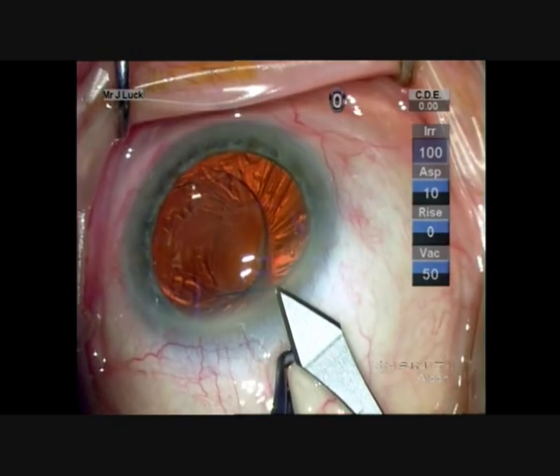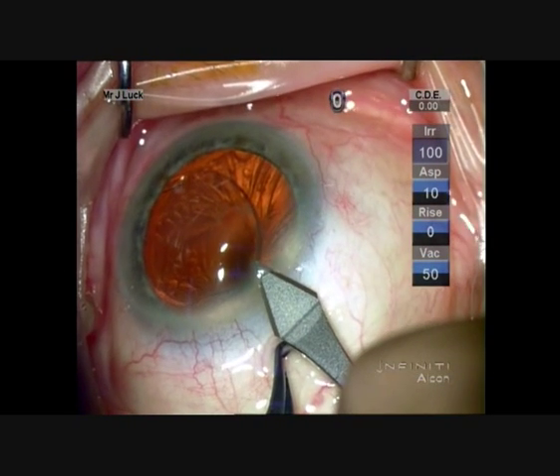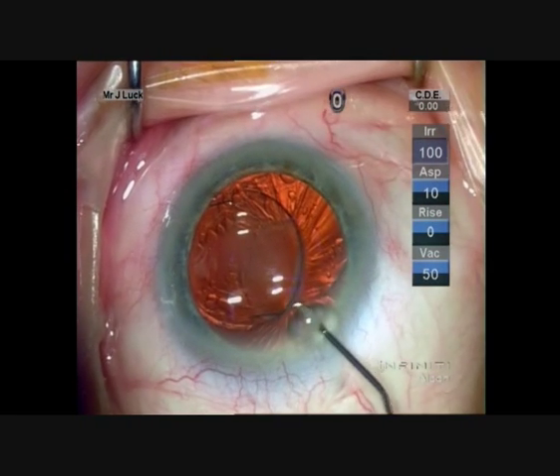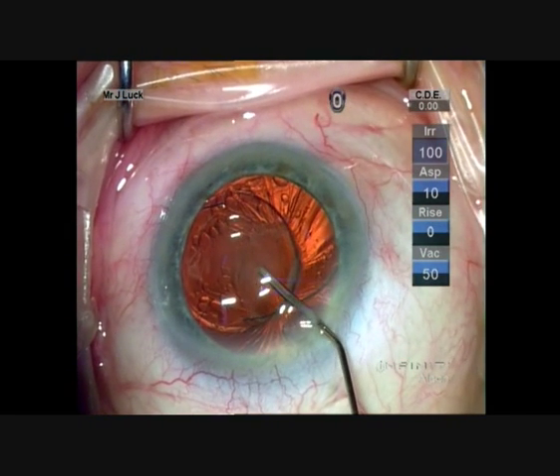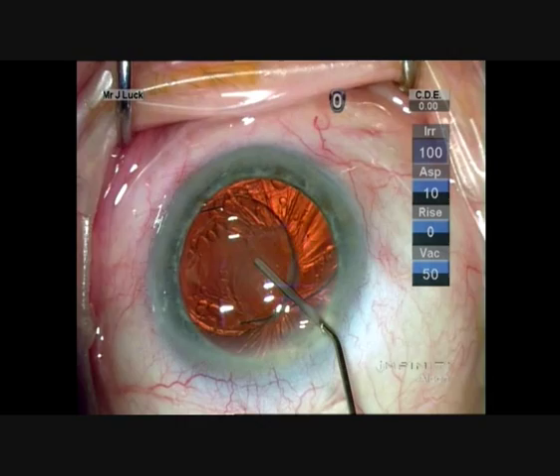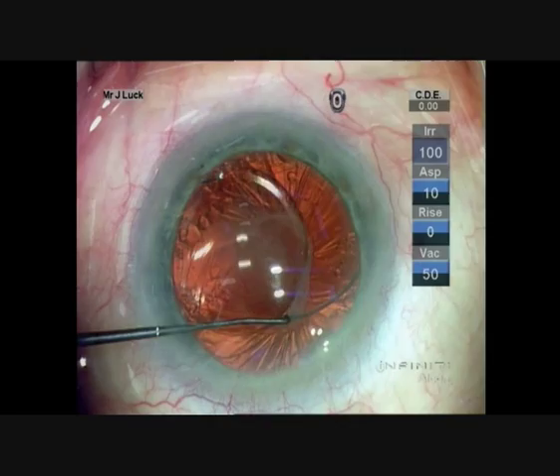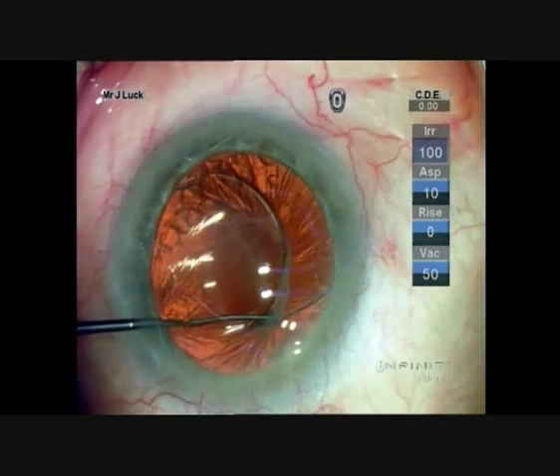We're going to make a relatively small keratome incision into the cornea, fill the anterior chamber with viscoelastic, and then very simply dial the intraocular lens out of its position and into the ciliary sulcus.